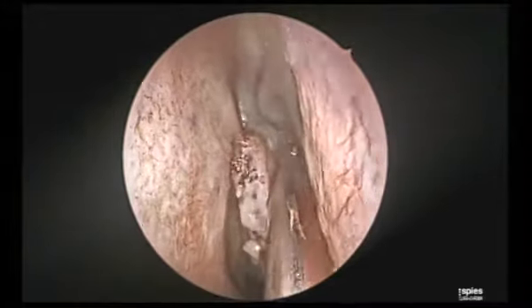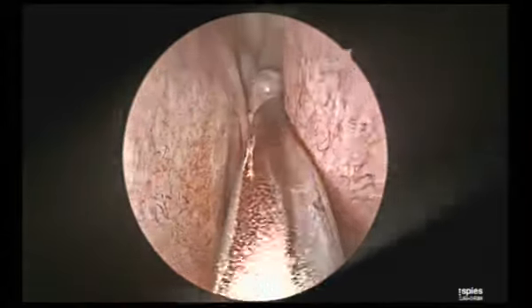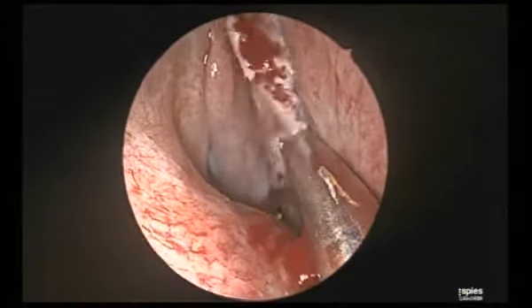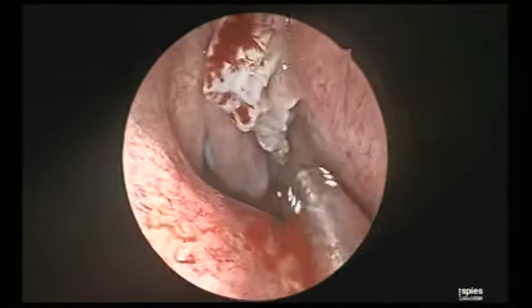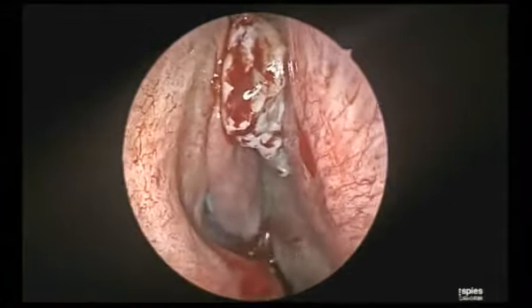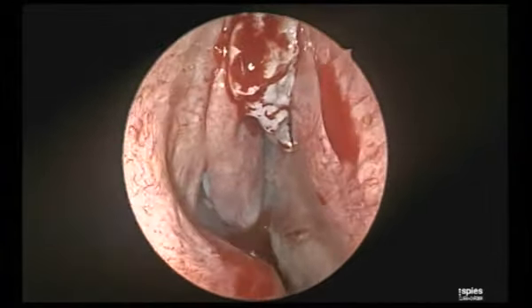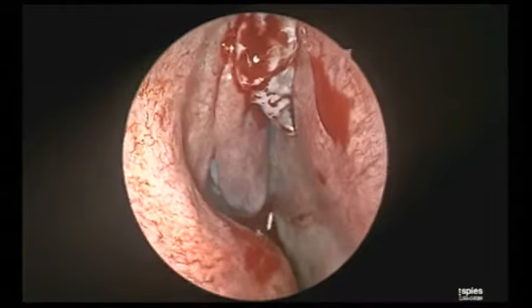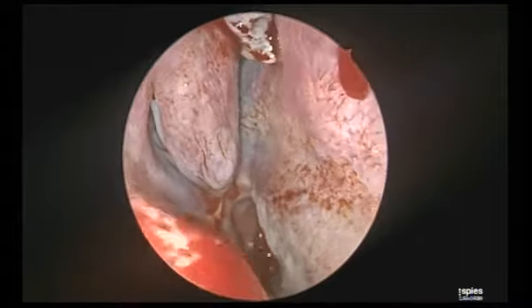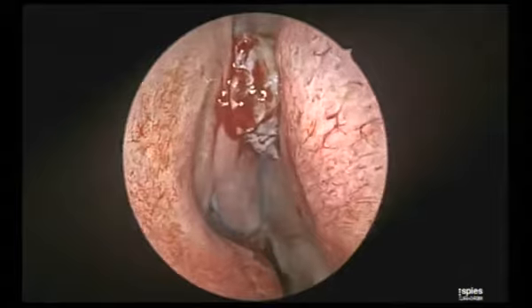You have to be careful in the packing solution used. Somebody in the audience said 4-1. So saline 1, adrenaline 4. The most important thing about this situation is to stay away from doing anything in the olfactory region. You also don't inject. Stopped.